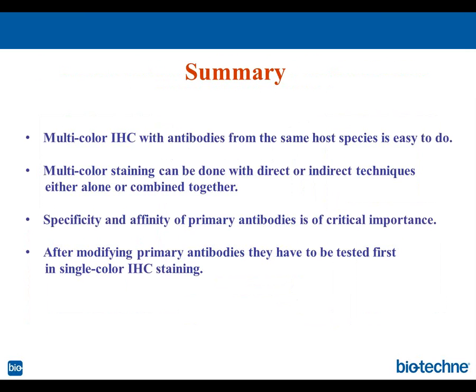Do you have any tips for using a primary antibody raised in the same species as the tissue sample? For example, using a mouse primary on a mouse tissue. It's a very good question. I was going to mention this, but because of the lack of time, yes, indeed. This trick we do here can also be used with mouse-on-mouse detection. And I can tell you what's happening.